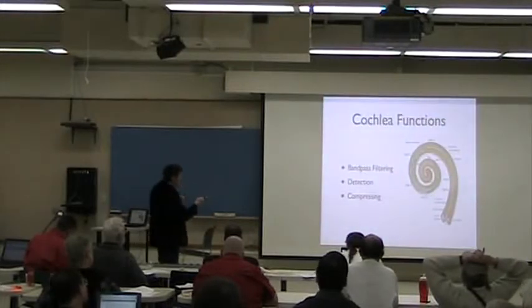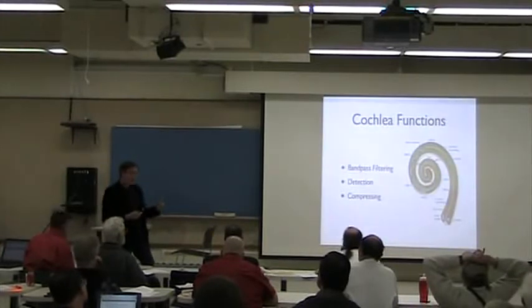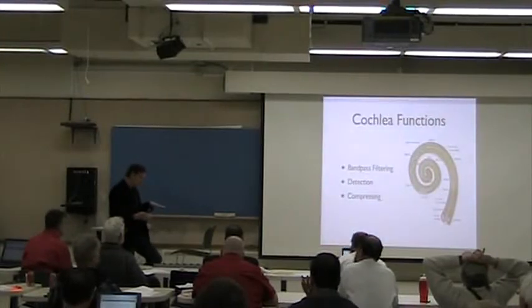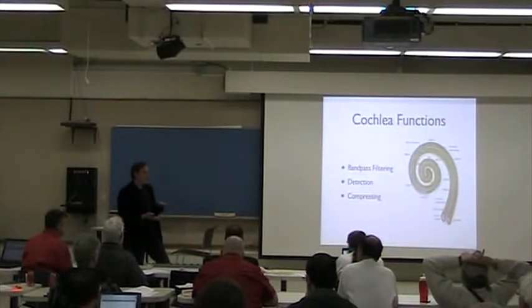And the third part is compression. Using the detected envelope, we amplify the weaker sound to make the dynamic range of the sound smaller.